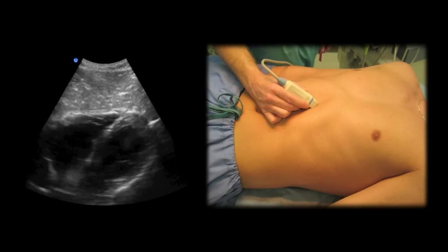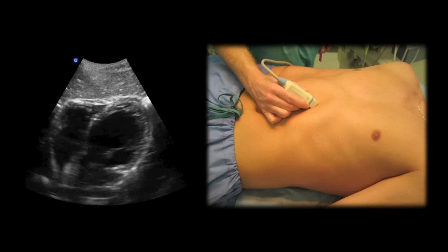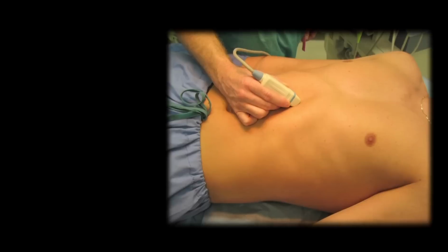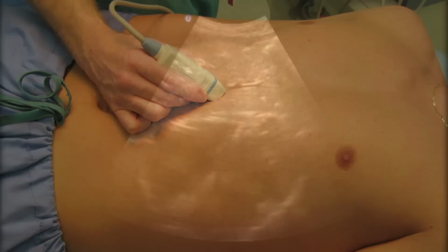The subcostal view may be the easiest to obtain in a critically ill patient who is in the supine position and cannot fully cooperate with the exam. The probe should be placed in the subcostal location with the probe marker dot pointed to the patient's left side. The probe should be aimed towards the left shoulder at a very acute angle to the patient's abdomen.